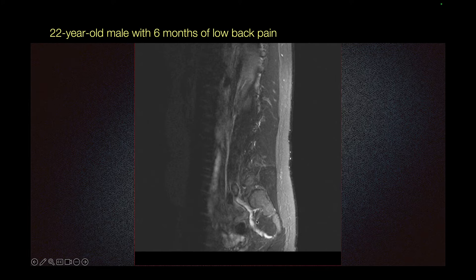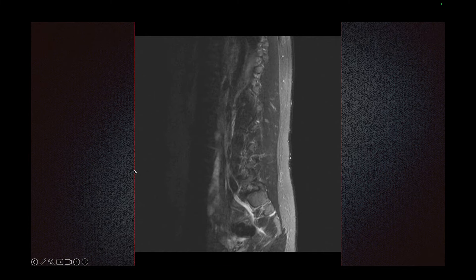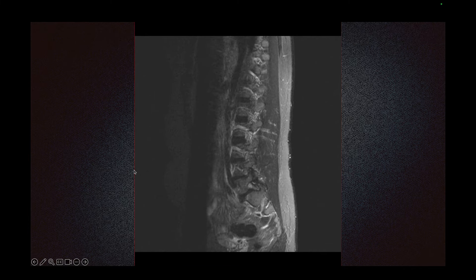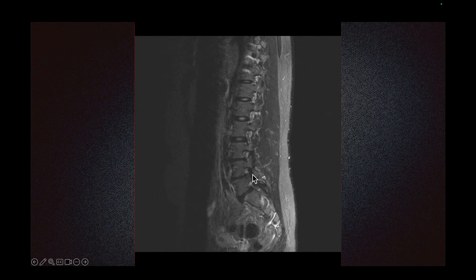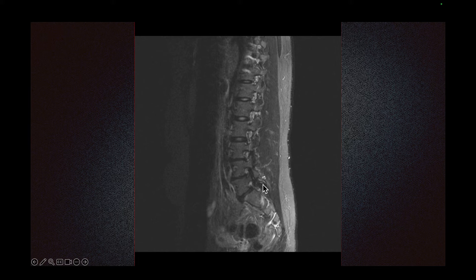I have another case of a 22-year-old male with six months of low back pain, and we have an MRI. As we scroll through the images, this is the L4 vertebral body and we see a normal pars. This is the L5 vertebral body, and we see that there is a pars fracture.